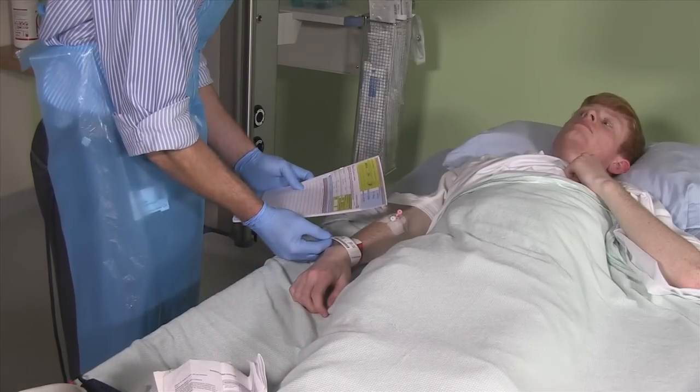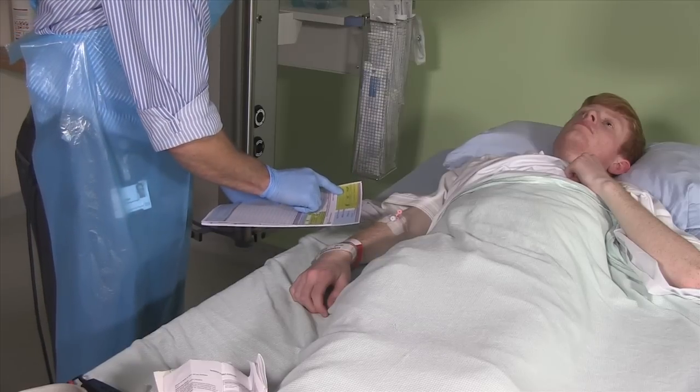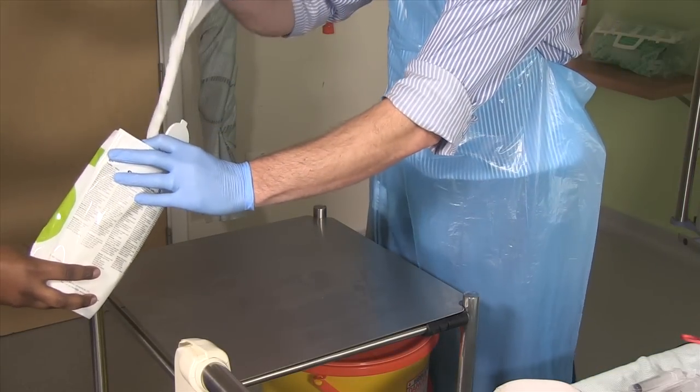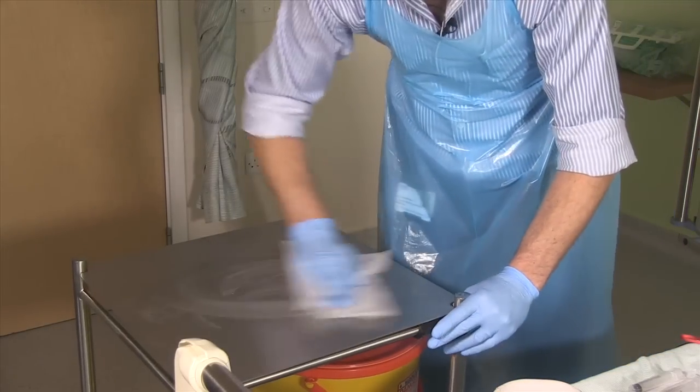Make sure that you've identified the patient and the drug prescription chart and that they match. Check for allergies both on the wristband on the patient and in the allergy box on the prescription chart. Make sure that you have a clean work surface and wipe it with a sterilising wipe.